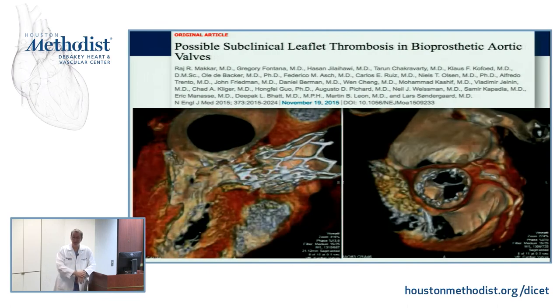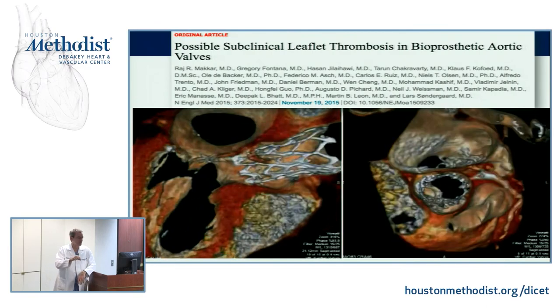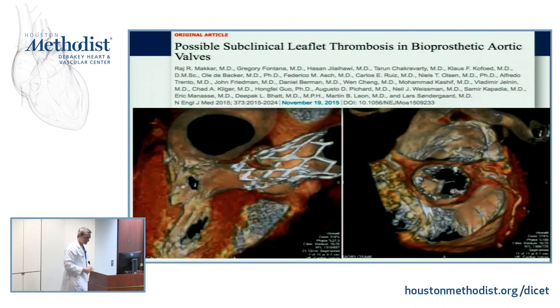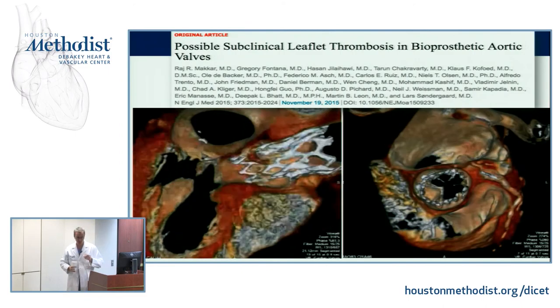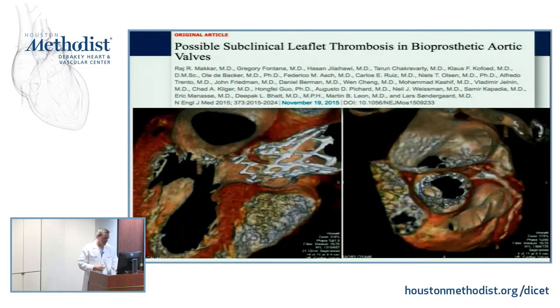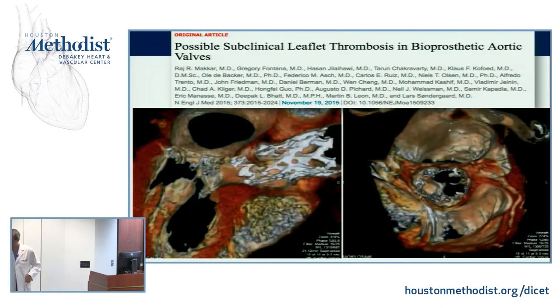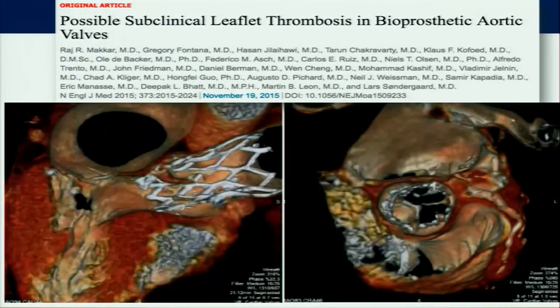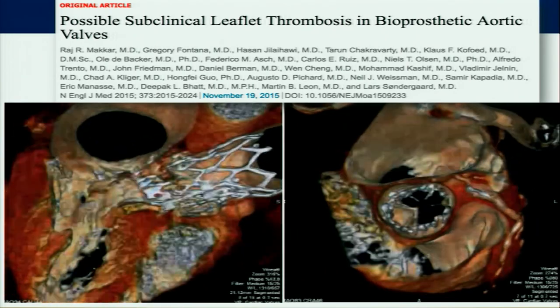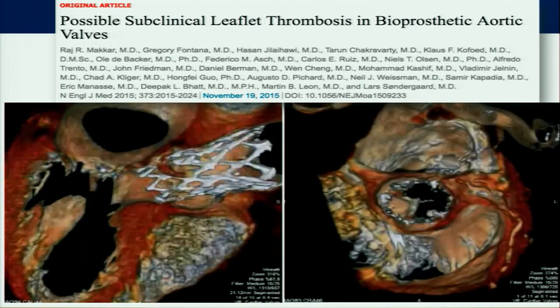This is a very clear connection: if you're a local PI asking to do an imaging or any other functional evaluation of a device inside another randomized trial, your findings go to the FDA. So that happened here. It's unlikely to happen again in our generation. No company will allow it again. But the issue here is that the hemodynamics of these valves are so good that you can fully obstruct one of the three leaflets and have no effect on the gradient. All you've done is go from an effective valve area of 2 down to 1.5, but 1.5 is not enough to change the gradient. So these are really asymptomatic functional imaging findings.